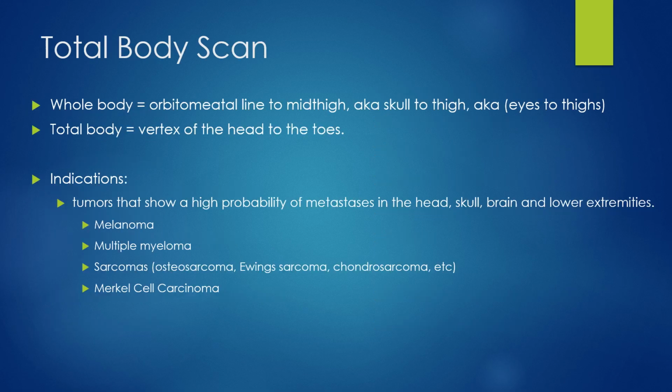Now for total body scan, this gets confusing a lot of times because some places use total body and whole body interchangeably, and this can really confuse schedulers. So it's important that you as a technologist know which protocol to do. The protocol is exactly the same right up until the point where you image them, and then it's just a matter of how much anatomy you're imaging.